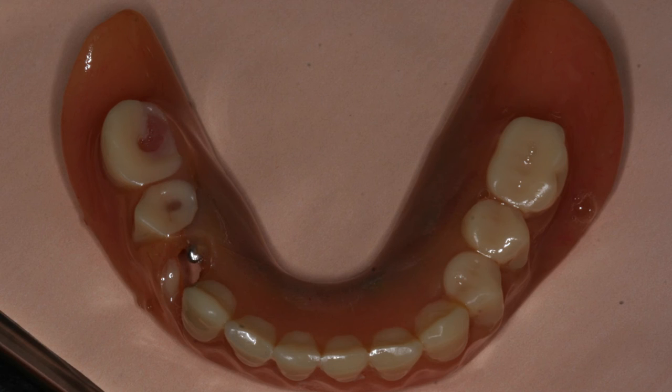Eventually, the denture teeth will wear down to the point where they are almost smooth. Some patients will notice this, others won't. If you're having trouble chewing your food, talk to your dentist. At that point in time, it's probably a good idea to get a new snap-in denture made. Make sure to keep your old snap-in denture as a spare.